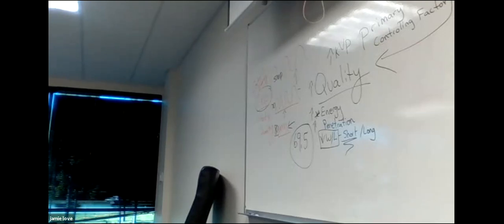So I'm just gonna go over a few of the charts. There's different things that these are used for, mostly to tell you about the energy of your beam, and if you change something, where does it shift on the energy level? So let's look at the first one.